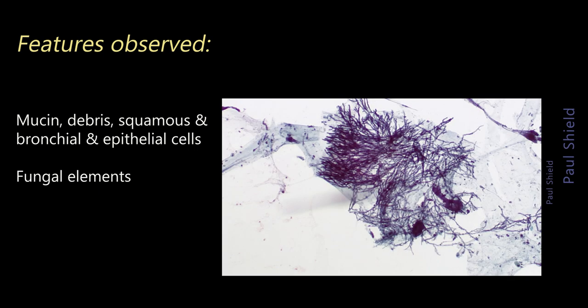So what was your diagnosis here? Well, the specimen contained all the usual sputum components, with epithelial cells, pulmonary macrophages, mucus, quite a lot of debris in this case. And the outstanding feature were the collections of hyphae. These looked different to Candida.